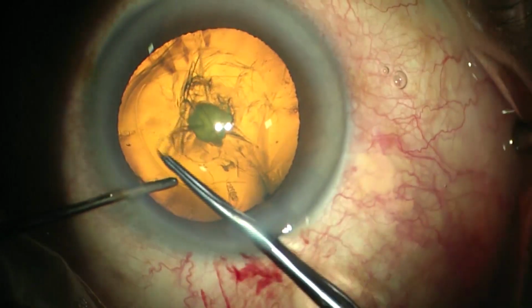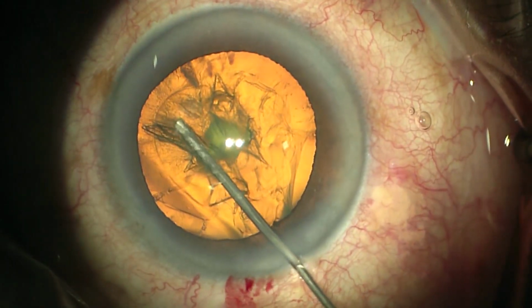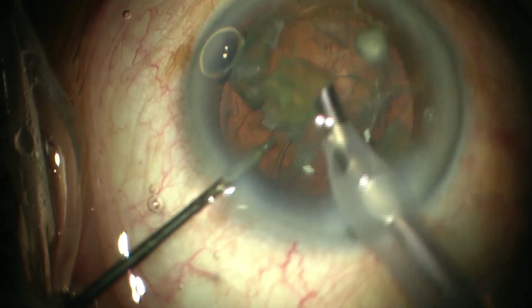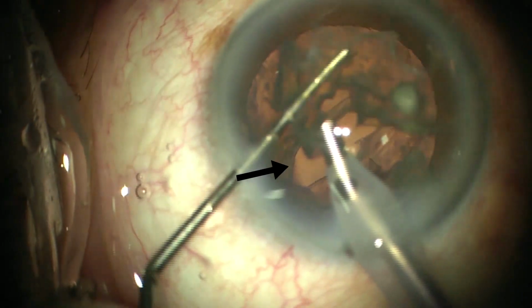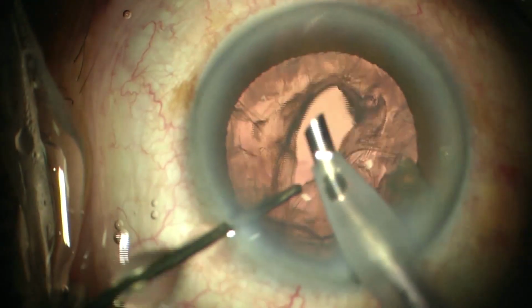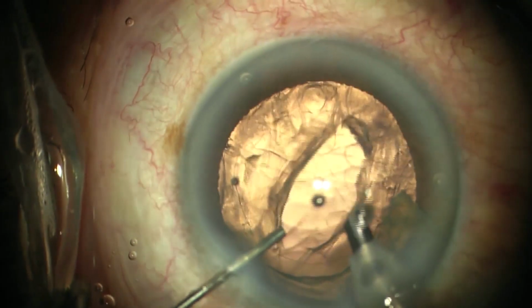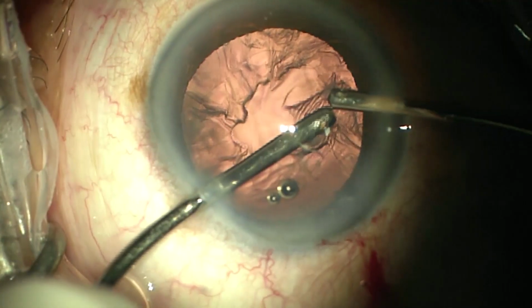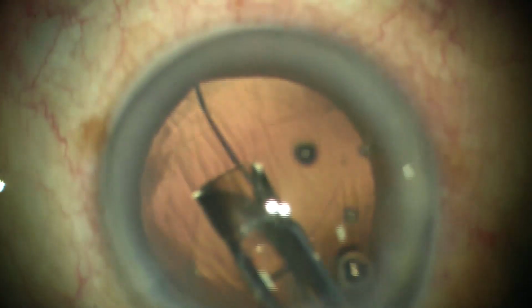This is a case of a posterior polar cataract with PCR due to pre-existing dehiscence in the posterior capsule. Typically, the PCR shows a split end with two pillars of PC, which is very characteristic of a PPC. The nucleus is removed using a bimanual method by maintaining the anterior chamber infusion port separately. A high-density viscoelastic is introduced before removing the phaco probe. A thorough anterior vitrectomy is done and cortex is removed using the bimanual infusion aspiration and cutting.